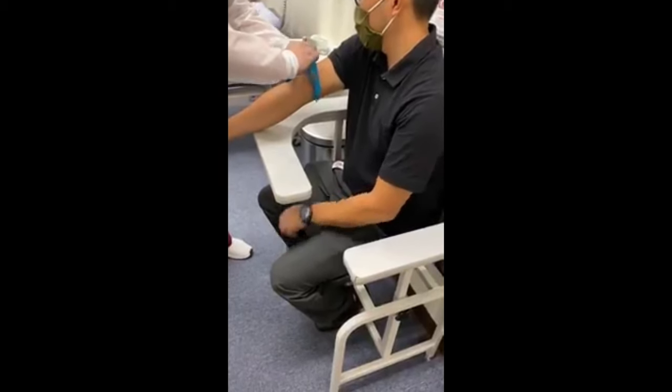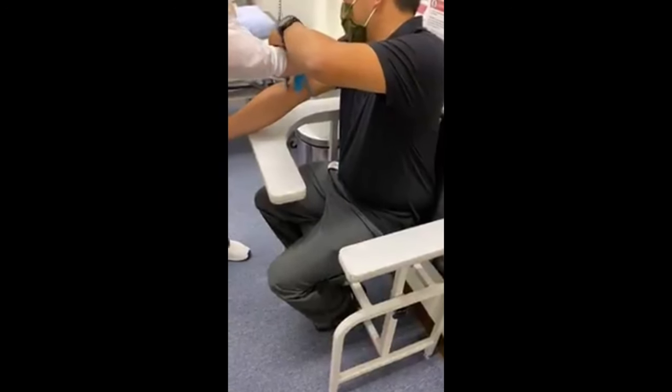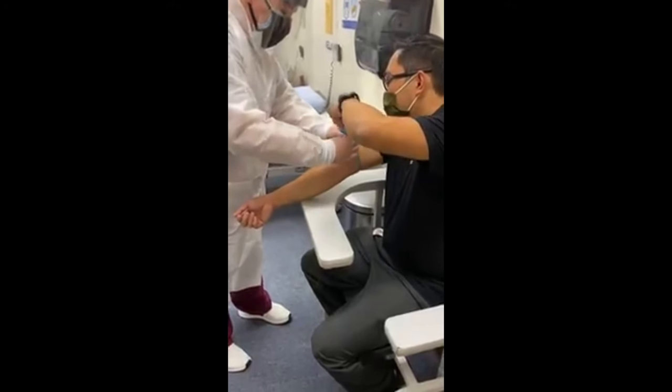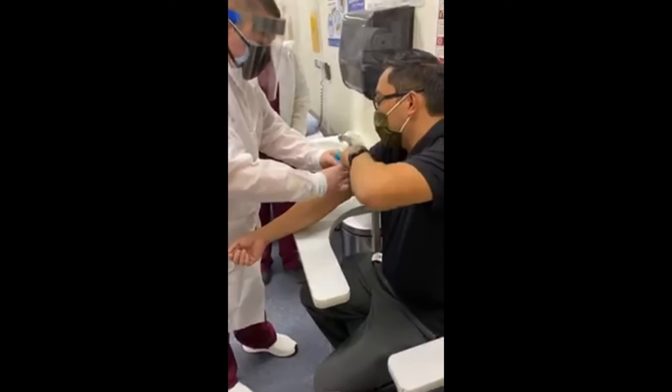Can I do it correctly? Yeah, like that. Then it has to cross over. Yeah, it has to cross over. Once you've made that X there, whatever is on the underside, you tuck this one underneath. I tuck this one? Here? There you go.